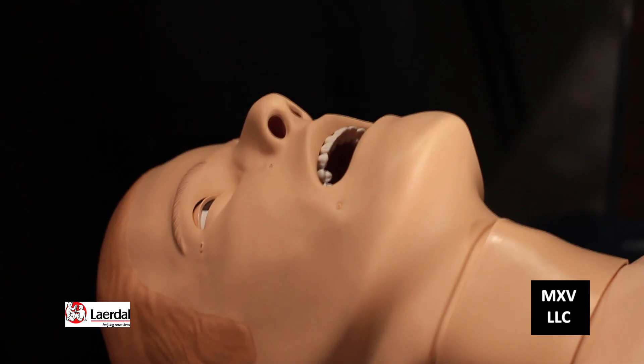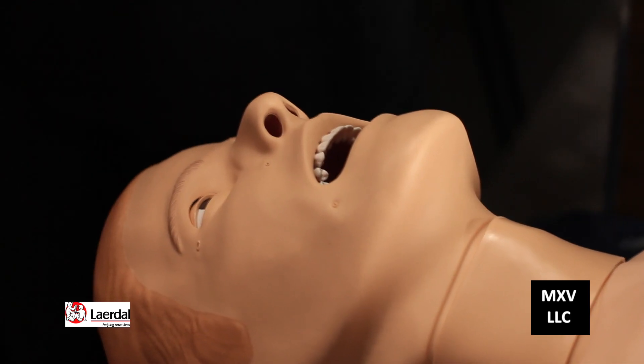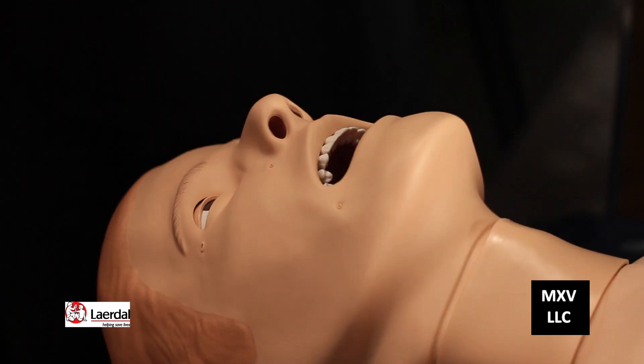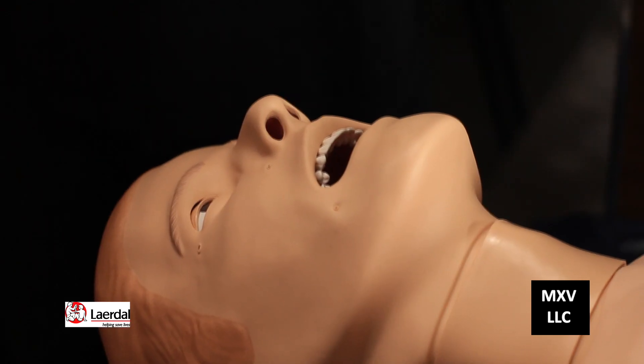Now let's go ahead and introduce ourselves to the patient and explain to him what we're about to do. Hi Mr. Foley, my name is Holly and I'm a student, and this is my instructor Rebecca and we're here to take care of you today. How are you feeling? — I cannot pee. — We're going to make you more comfortable.